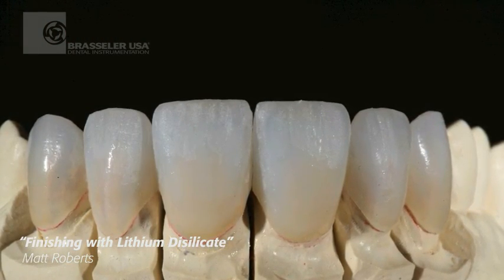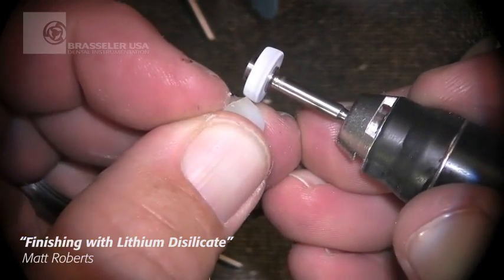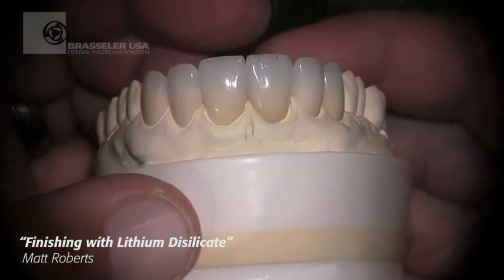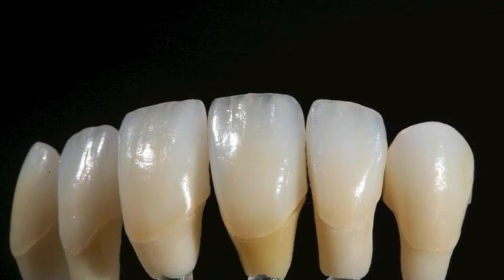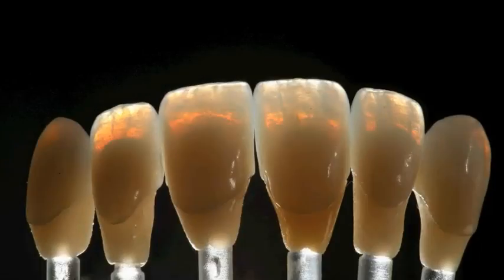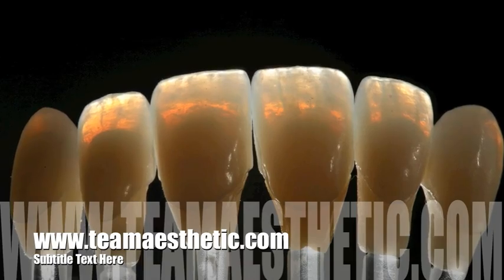Once we finish that, we're ready to stain and glaze. We'll do a little bit of final adjusting with a gray-white rubber wheel from Brassler to help adjust contacts and to give us our surface prior to diamond polishing. Hope you've enjoyed our video today — our entire video series can be viewed at www.teamesthetic.com.